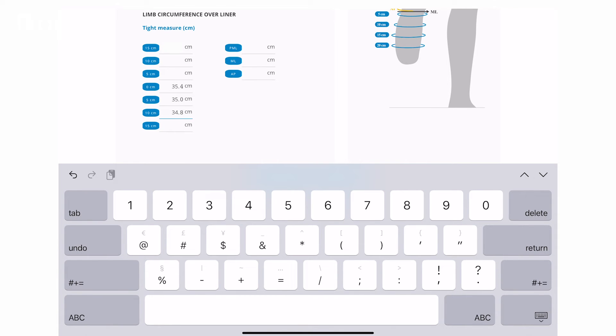If the most distal measurement location is difficult because the tape measure wants to slide off, it's okay to leave that field blank.